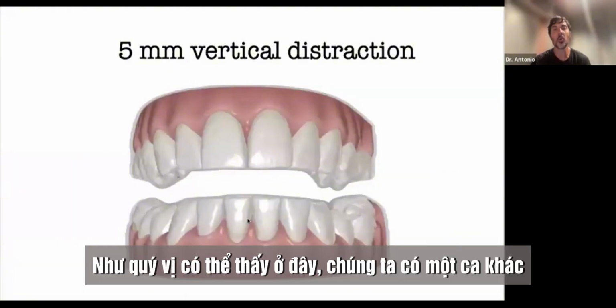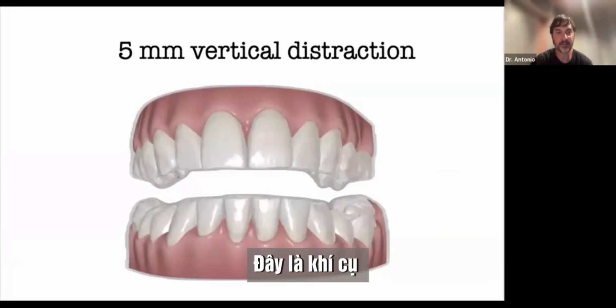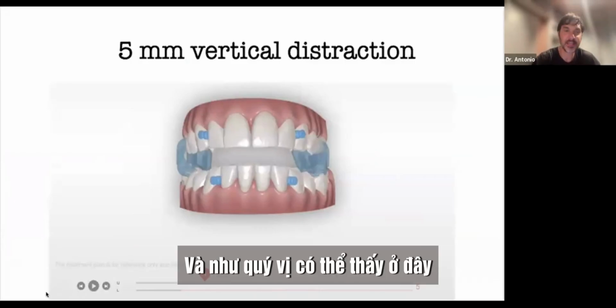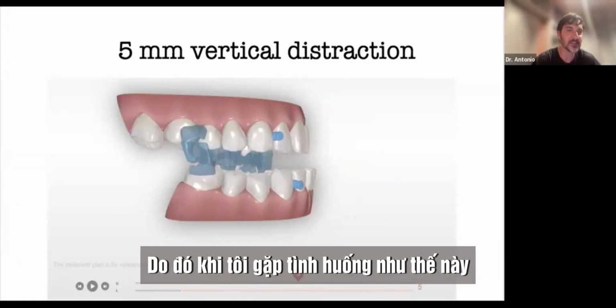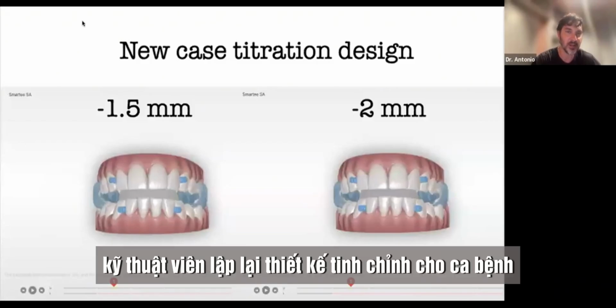As you can see here, we have another case with 5 millimeter of vertical distraction. This is the device in place from the Smartee digital program. And as you can see here, for me, also that situation is too high vertical distraction. So when I find this kind of situation, before accepting the case, I always ask the technician for a new case titration design.